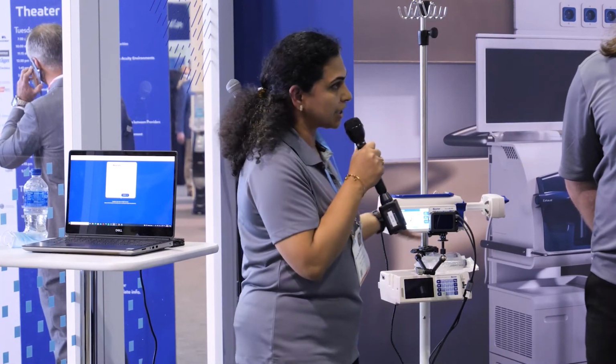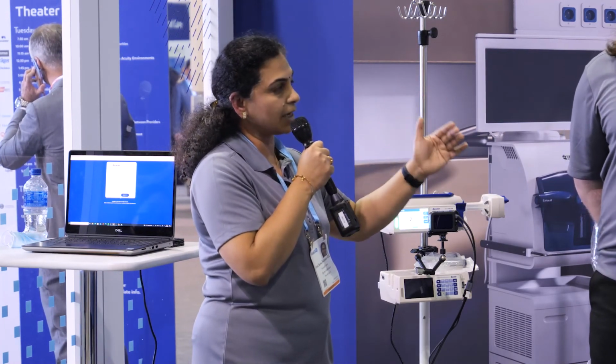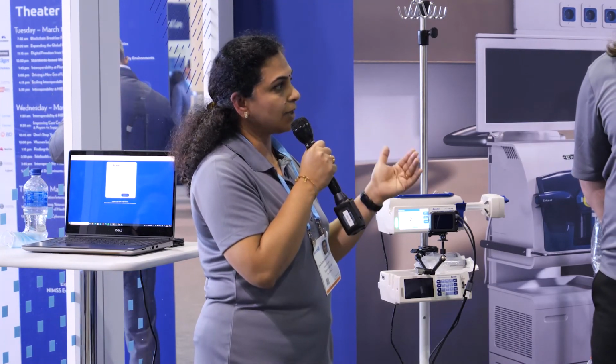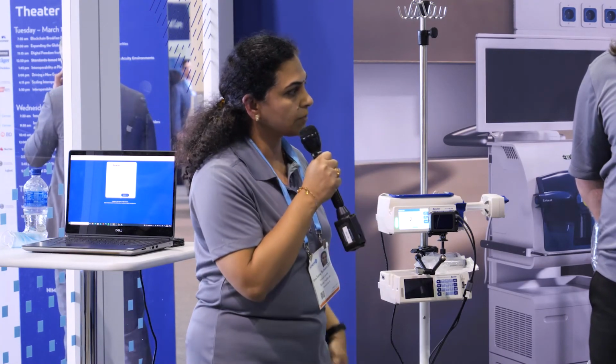So now the patient data flows back to Epic, then Epic can decide whether the infusion program is running correctly on the pump, and they can make a timely decision on the program. So now going back to Epic.